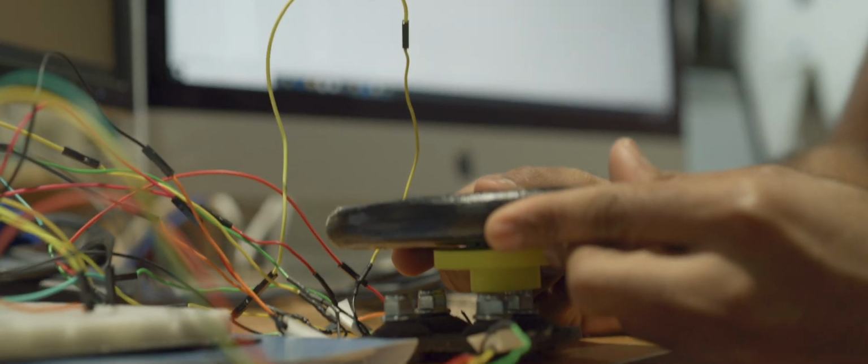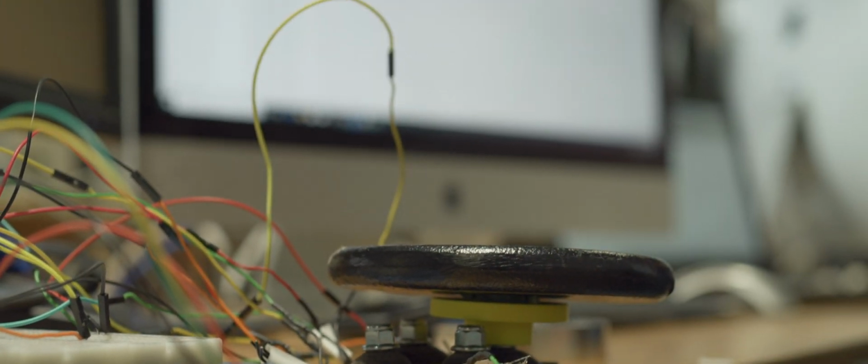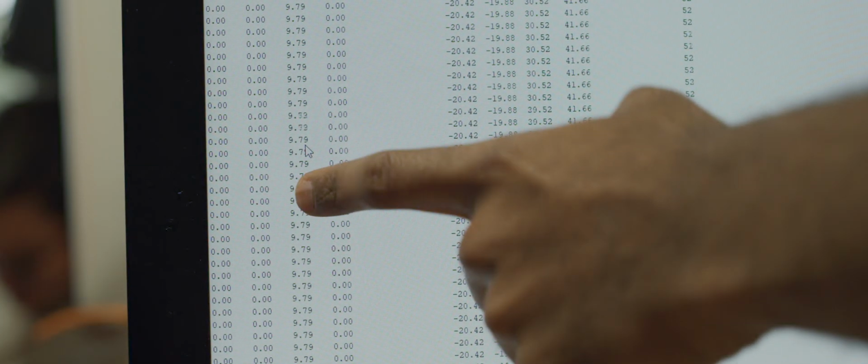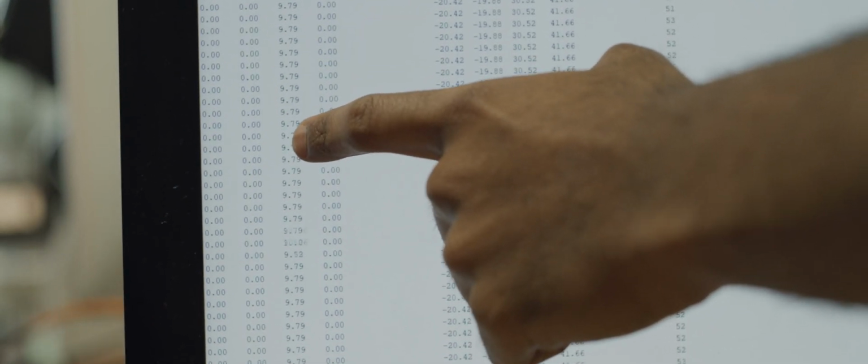And based on the particular force value, we can find the center of pressure and the other details when you're walking or like when the toe is off or when the heel is down. So I've been working on that and okay. So this is the force value that we are finding from the pressure sensors. And right now I've loaded the third sensor. So I'm able to see the value in the third row.